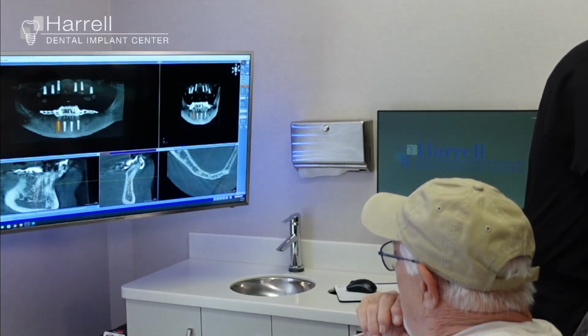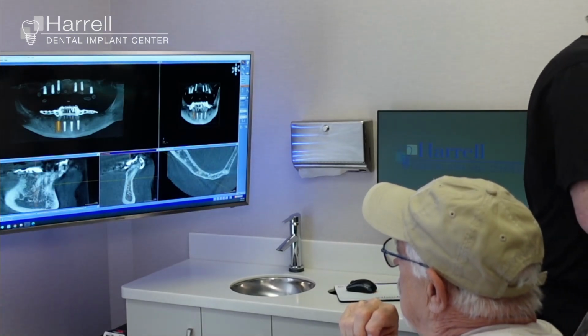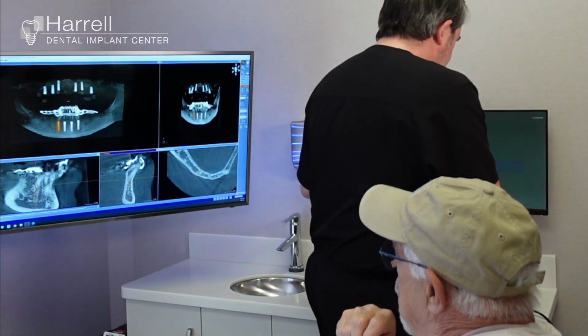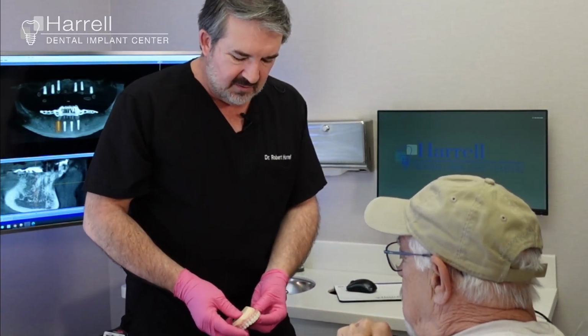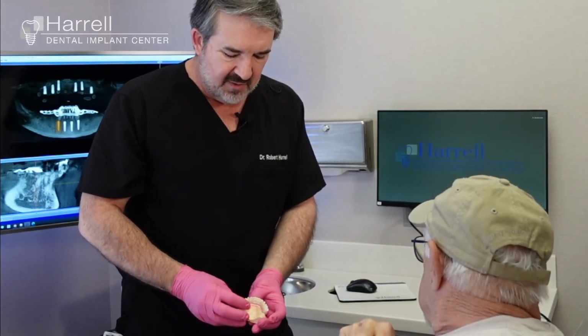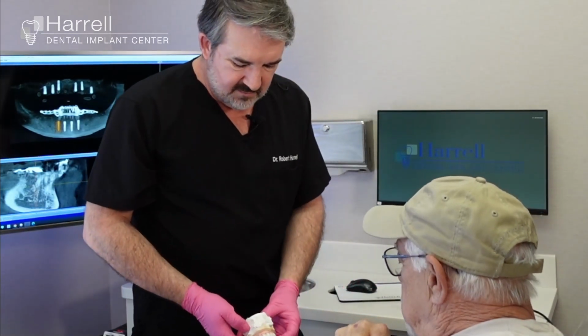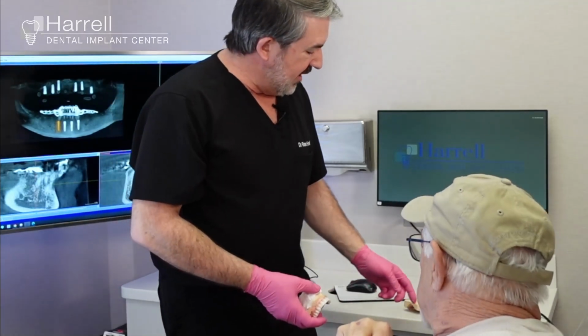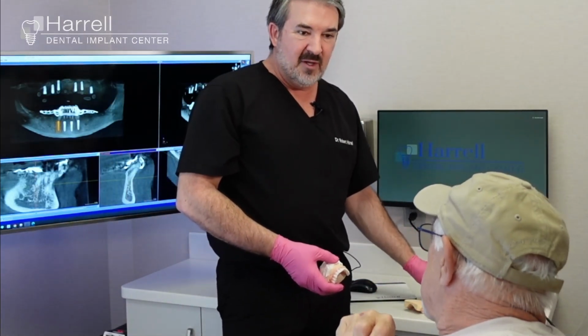Okay. Oh, yeah, with less gum. Do you have a provisional set? Here's one that may help you to see. That's one with a little less gum, and that's zirconium as well. There's another one. Yeah, that's probably kind of an extreme example. Probably not the best one to show you.